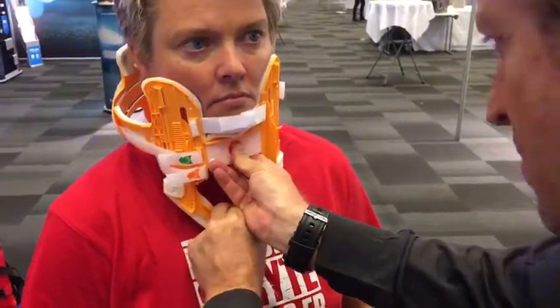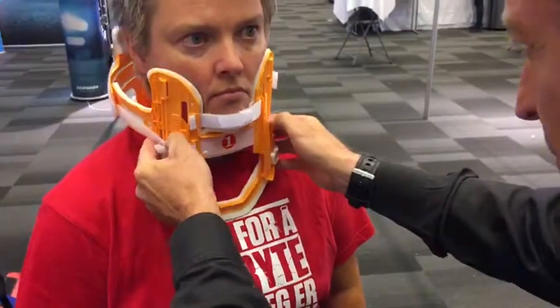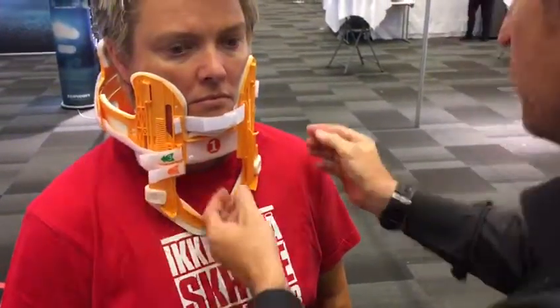We're going to bring this down. Check about the clavicles — a little more maybe. There you go, that should be good.